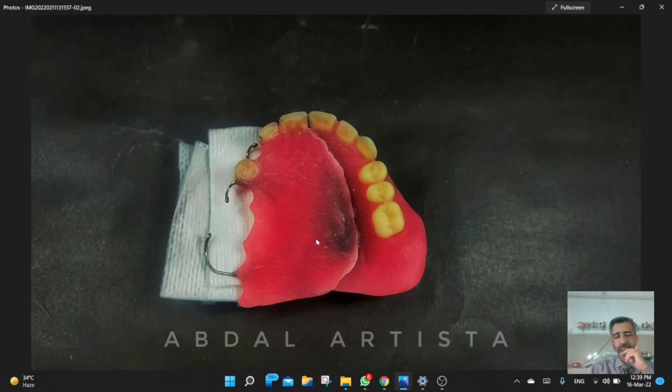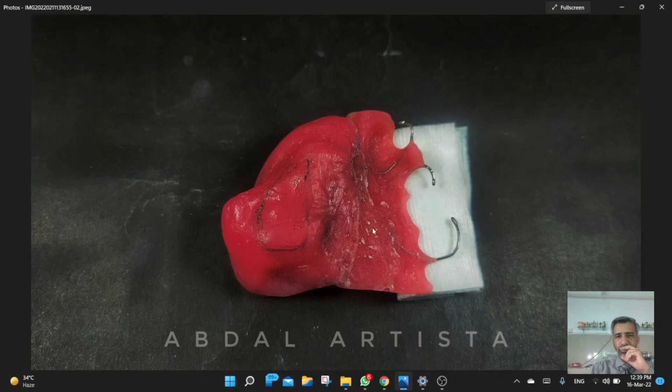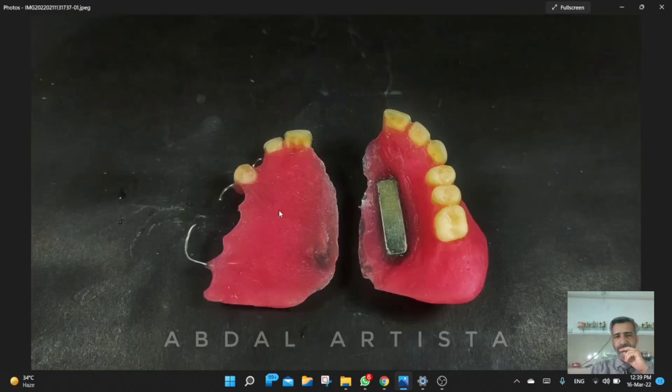This is the final wax-up before flasking, and this is the final processed appliance after the curing process. In this picture you can see that this area has been marked because we decided to create a hollow shape in this area to reduce the weight of the obturator — this obturator or bulb part covering the defect. This was the magnet applied in the final prosthesis.